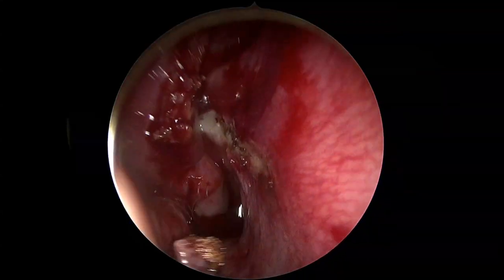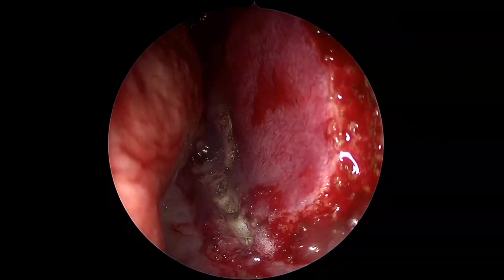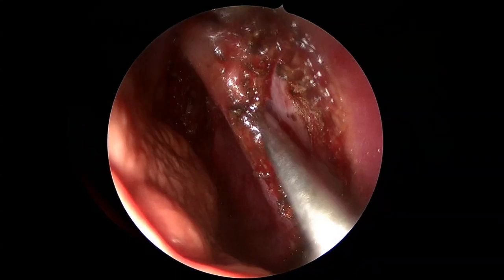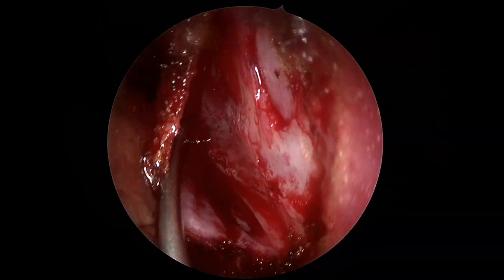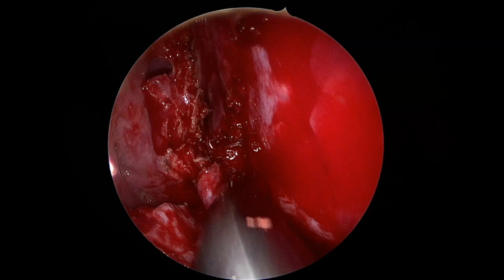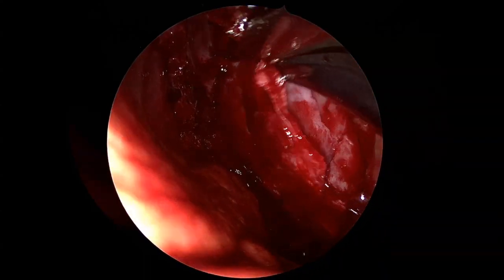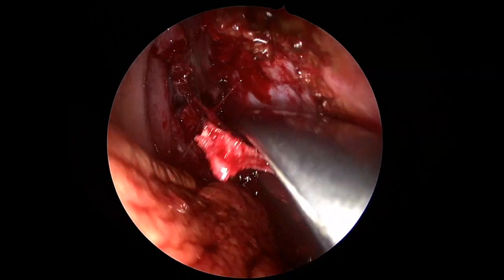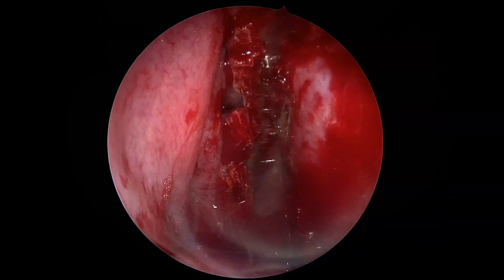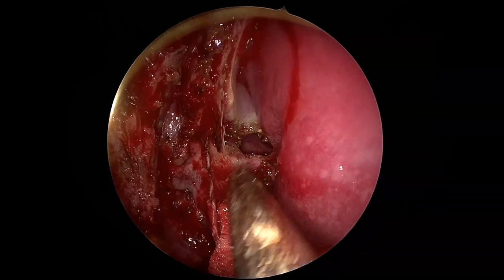The postero-inferior incision was made along the border of the septum and the nasal floor. Both incisions were joined vertically. The flap was dissected off the osseo-cartilaginous septum and placed in the oropharynx. Posterior septectomy was performed, preserving the bone graft for reconstruction. Nasoseptal mucosa along the corridor was cleared and hemostasis was achieved using a coblator.